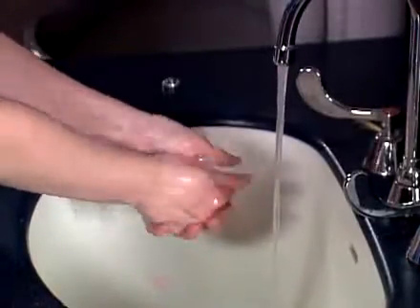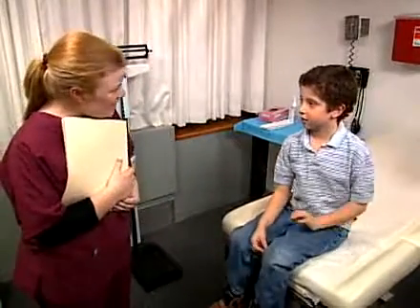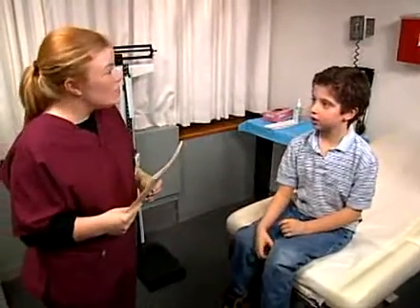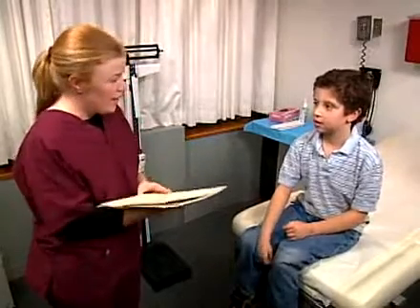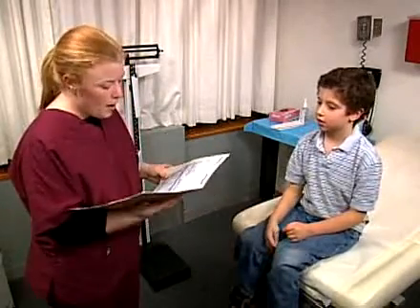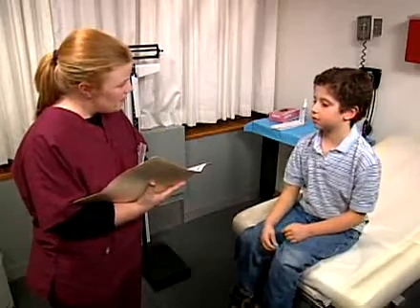Sanitize your hands. Hello. Are you Brendan? Yes. Hi, my name's Michelle, and this is your mom? Yeah. Hi, nice to meet you. We're going to see how tall you are today and how much you weigh. Let me check your birth date first. When were you born? April 16th.